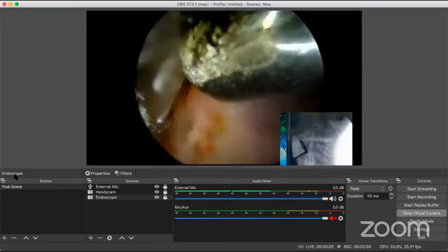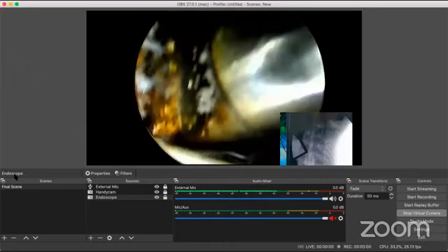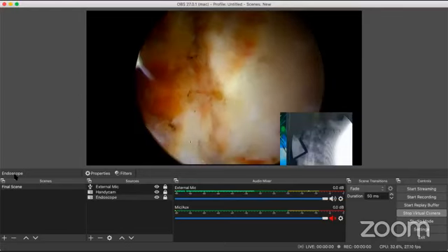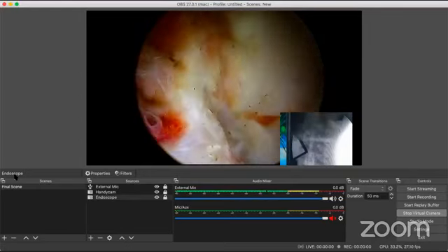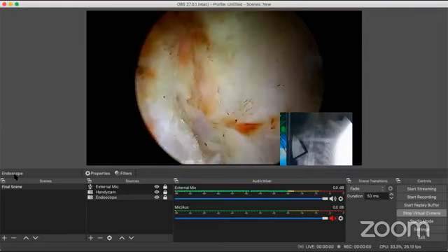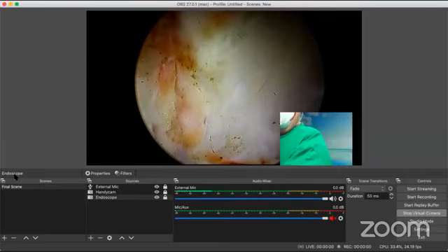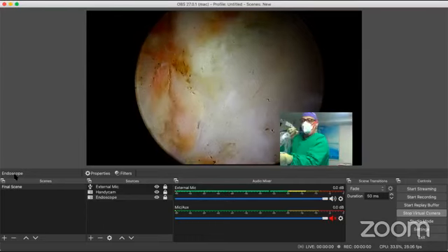So some little fine cleaning up, fine pushing away of some tissues. Okay, thank you. Now I'm going to take a diamond tip burr. There is no role for a cutting burr, according to me at least, in cervical spine surgery. This is a diamond tip burr. Can you please focus on me, Dr. Shirley, please? CM job is done now. I'm going to use a diamond tip burr.